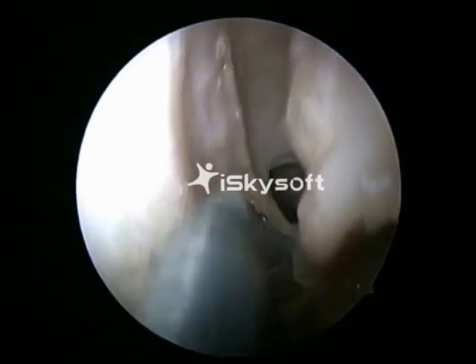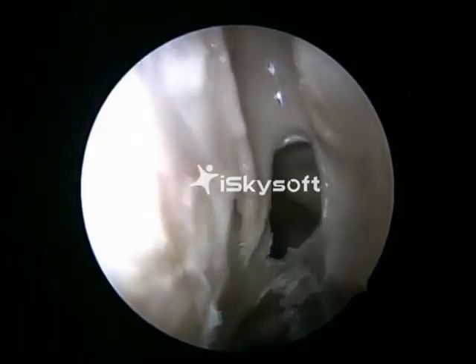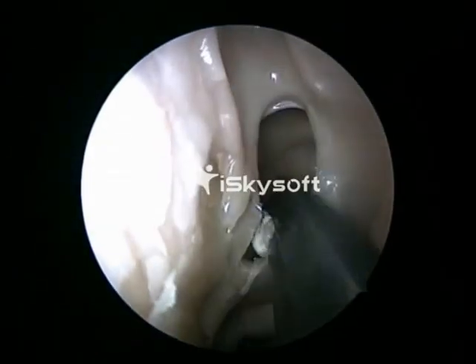Some surgeons secure this flap in a middle meatal antrostomy, but we don't do that.